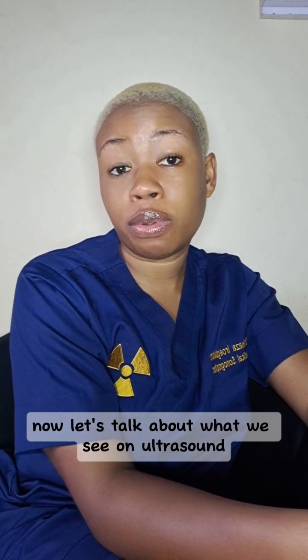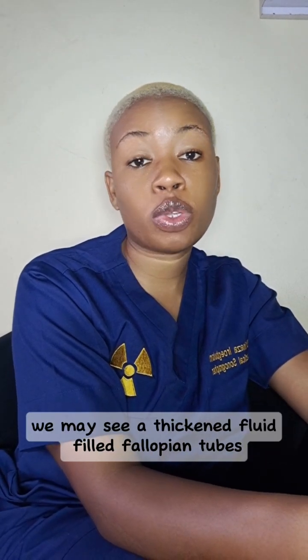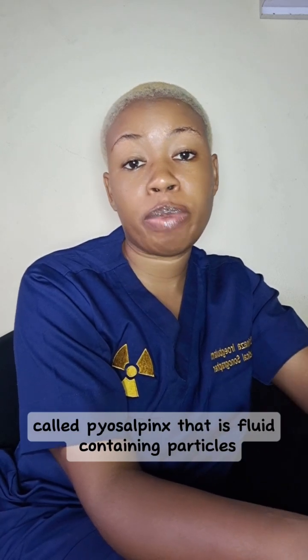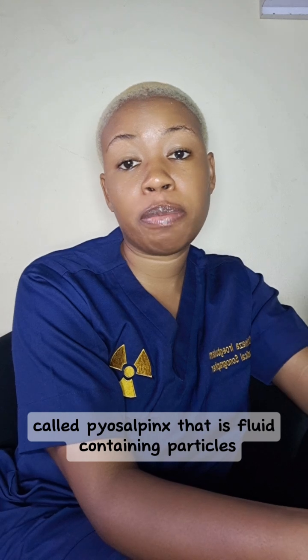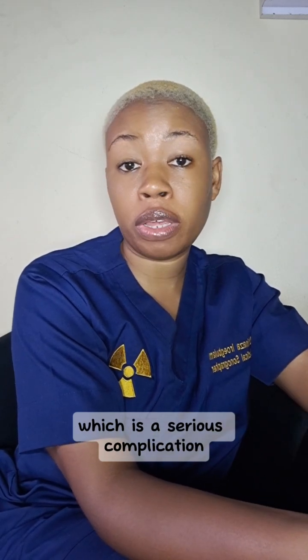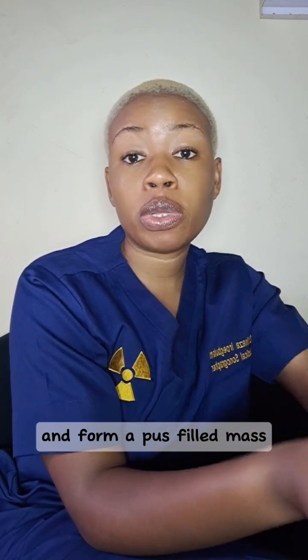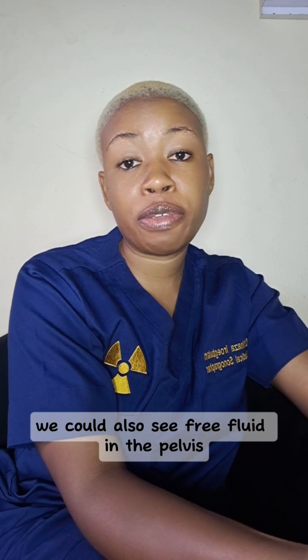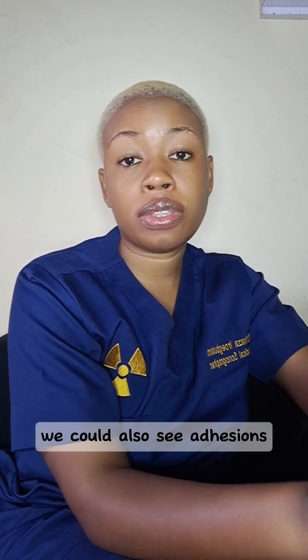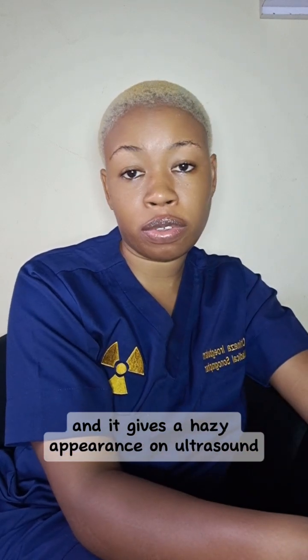Now, let's talk about what we see on ultrasound. In severe cases, we may see thickened fluid-filled fallopian tubes called hydrosalpinx. We could also see complex fluid collection called pyosalpinx, that is fluid containing particles. We could also see tubo-ovarian abscess, which is a serious complication. This simply means that the tube and the ovary become stuck together and form a pus-filled mass. We could also see free fluid in the pelvis, or what we call the pouch of Douglas. We could also see adhesions, making organs look stuck together, and it gives a hazy appearance on ultrasound.